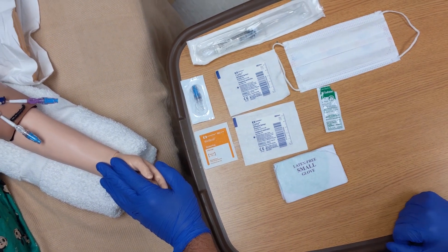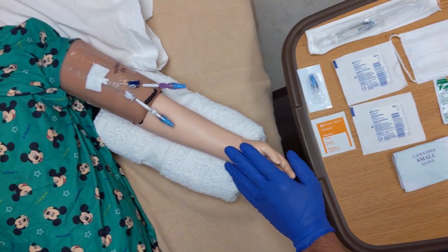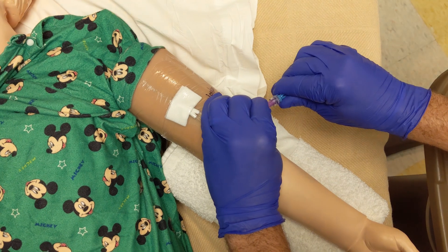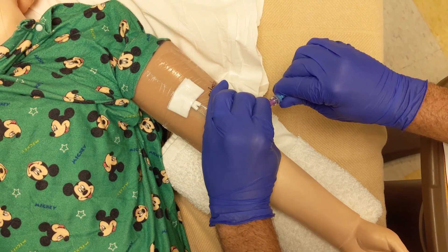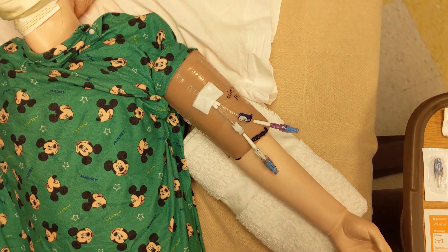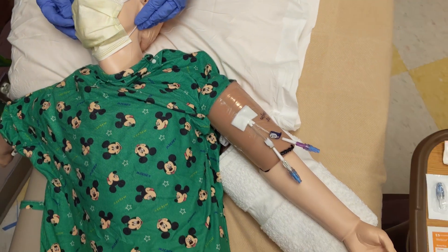When you're wearing regular gloves, not sterile gloves, you want to reach over and loosen the cap on your patient's line. Do not remove the cap completely — just ensure that it's loose enough that when you have sterile gloves on, you'll be able to remove it. Then place a mask on yourself, the patient, the person helping you, and anyone else within three feet of the patient.